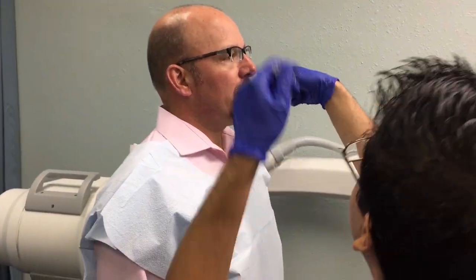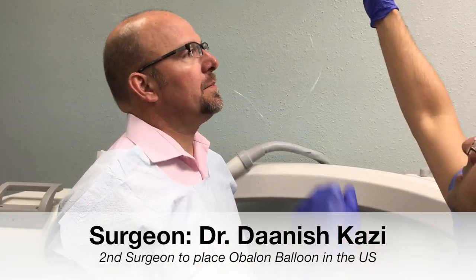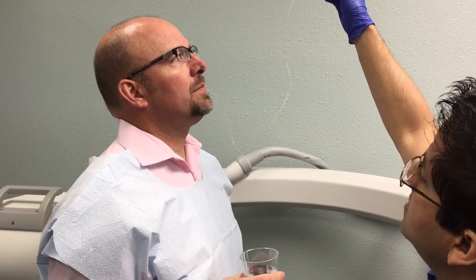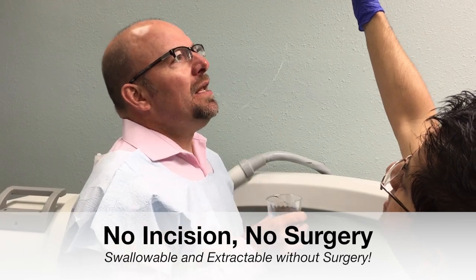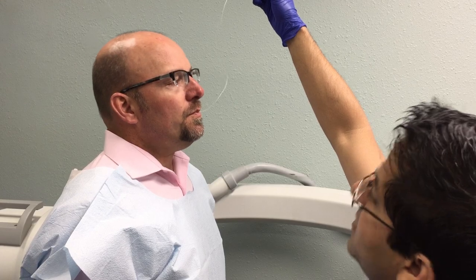Back of your tongue, help it up. Is it bad? Go ahead and start swallowing. Turn it back and start swallowing with a big swallow of water. Take a big swallow of water, help it back. Big mouthfuls. Does it pass your mouth? Good.